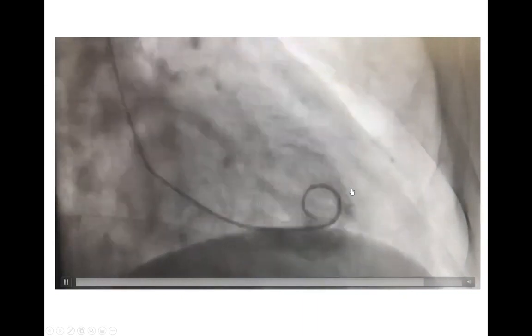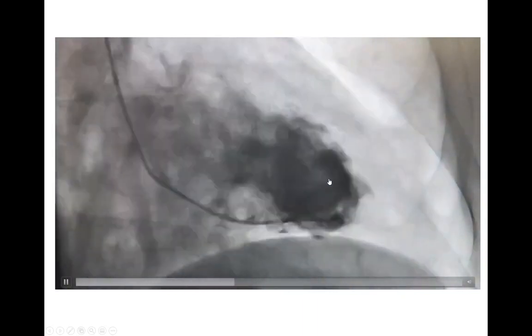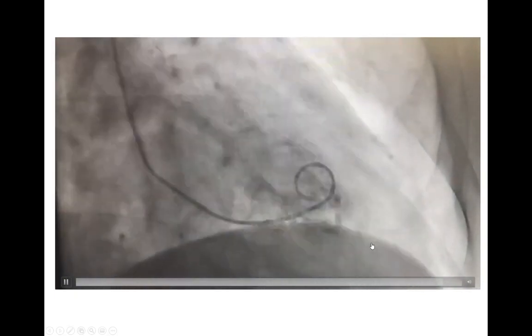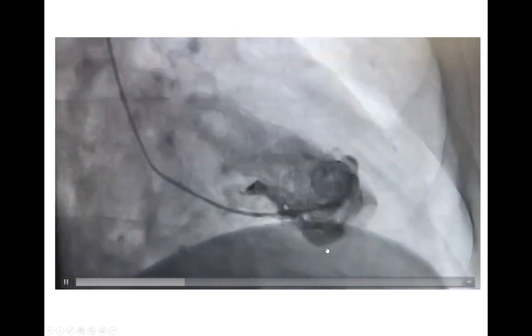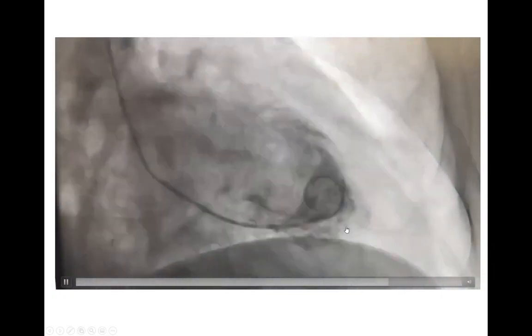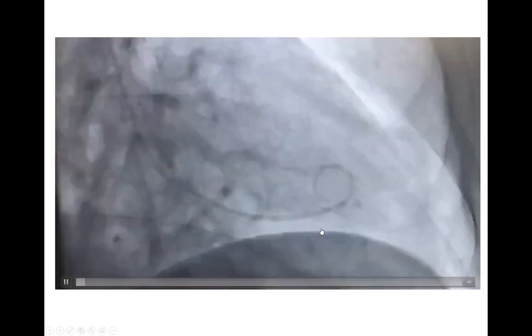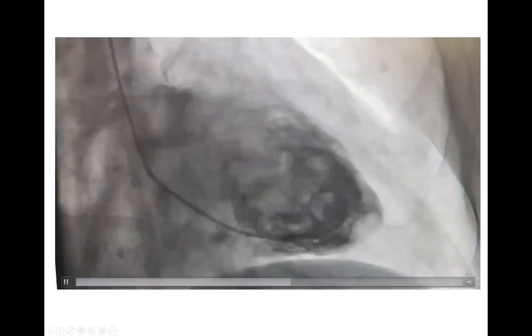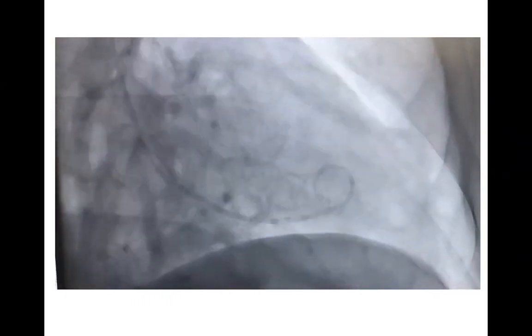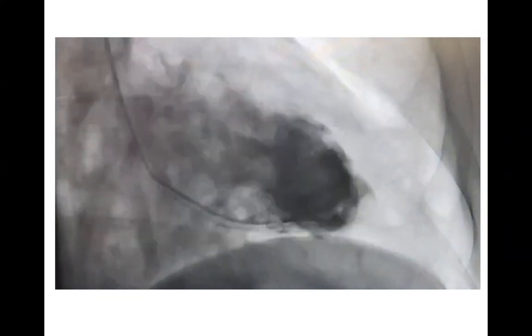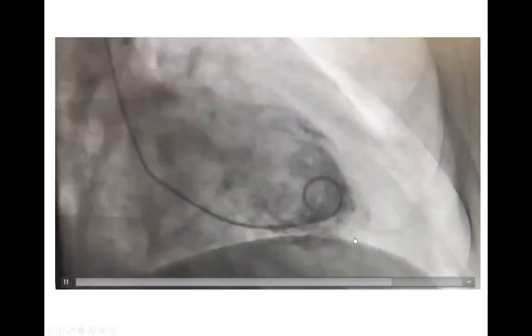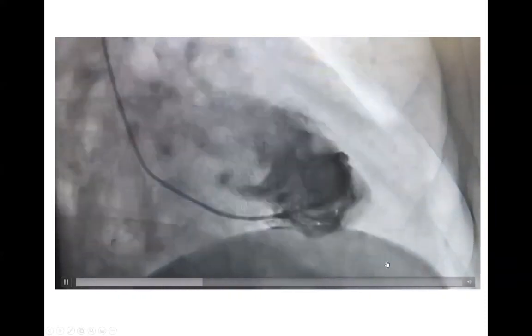The apex is akinetic, dyskinetic — slightly dyskinetic, definitely akinetic. It's moving opposite to the rest because it's fully akinetic and being pushed paradoxically during systole. There is apical akinesis with a slight dyskinesis that was missed on echo, which is not unusual because the very distal apex is frequently missed or foreshortened on echo. They may cut through and miss the true apical abnormality.